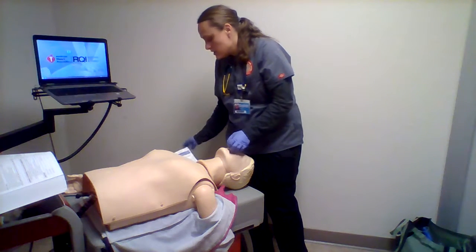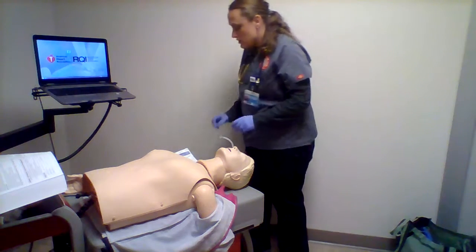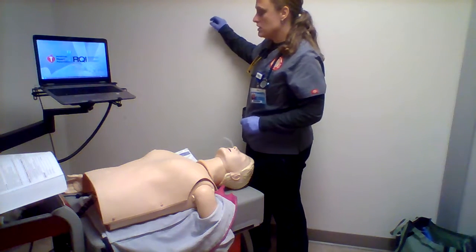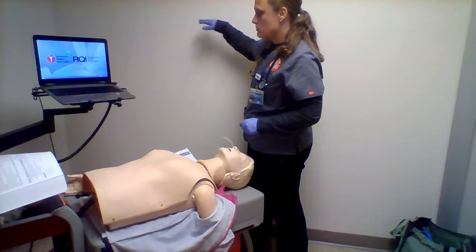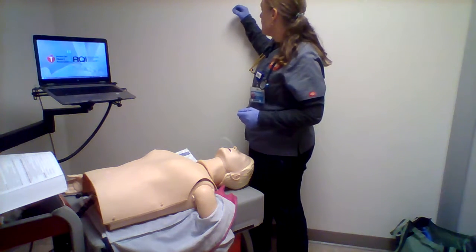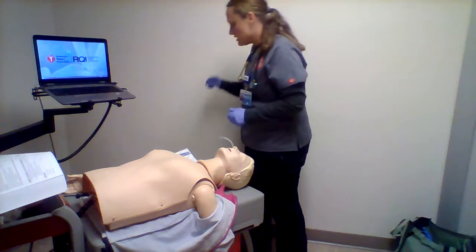So we'll take the suction and look at that. We've got some water nearby. My suction tubing is already connected to the suction unit on the wall. All the ports are closed. It's set between 120 and 150.